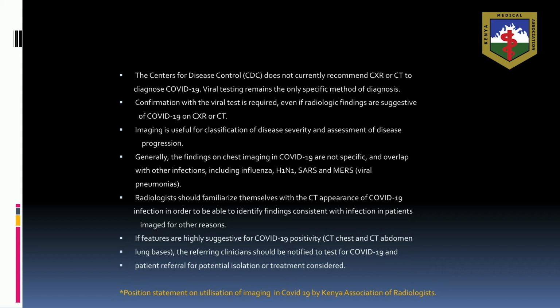The main thing is that you require confirmation with a viral test, even if the radiological findings are suggestive of COVID-19 on chest X-ray or CT. That means once you get the findings, the ideal is to get a reverse transcriptase PCR test to confirm it.